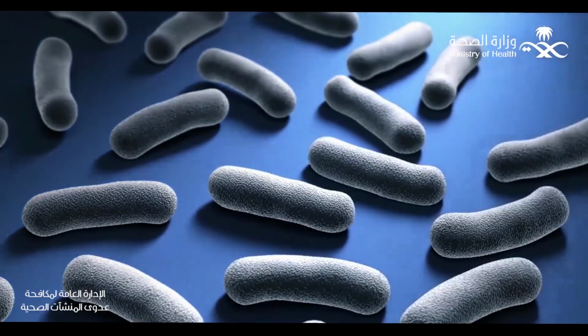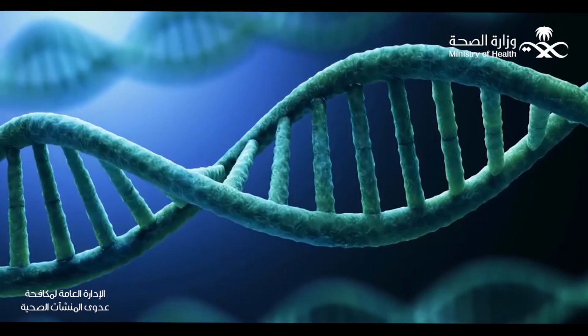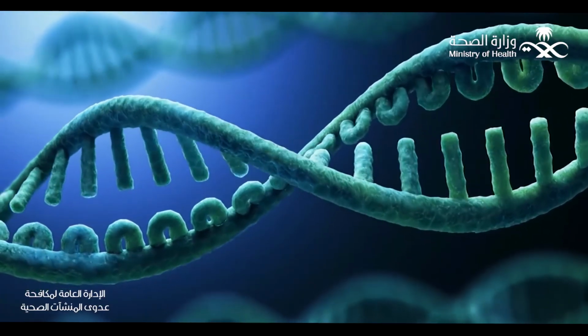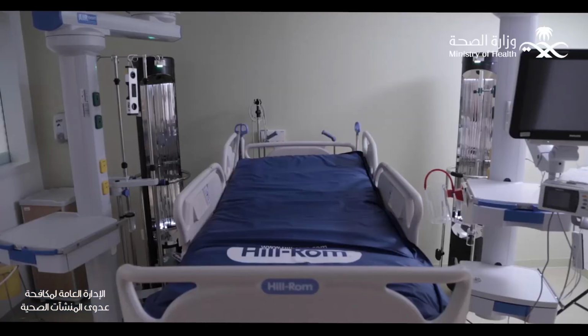This technology works to disinfect the room by dismantling the DNA links inside the germs, as the towers have a 360-degree automatic rotation feature, which ensures that the room is completely disinfected.